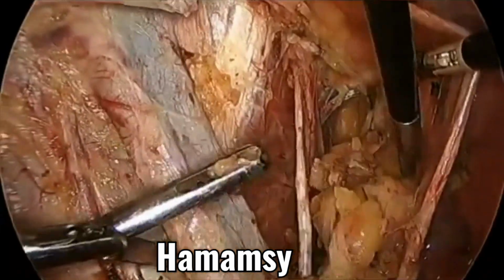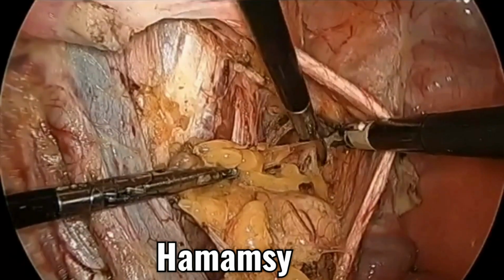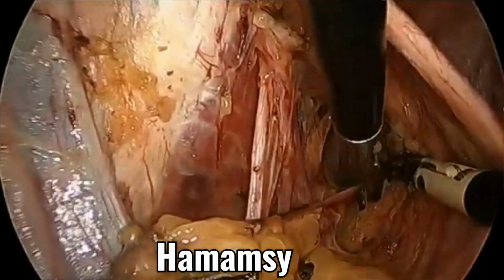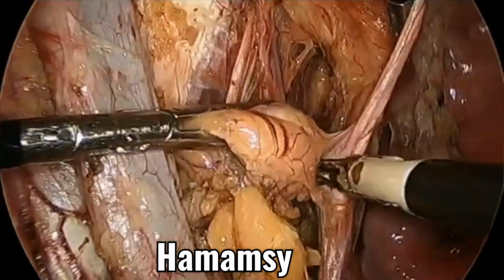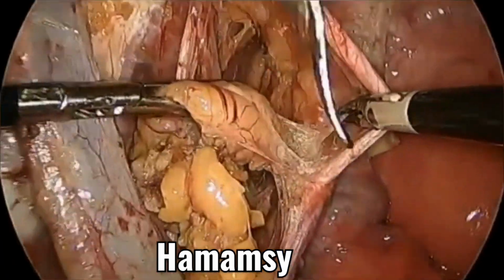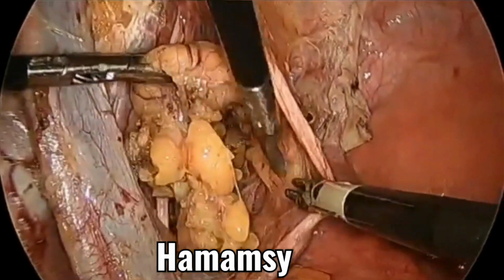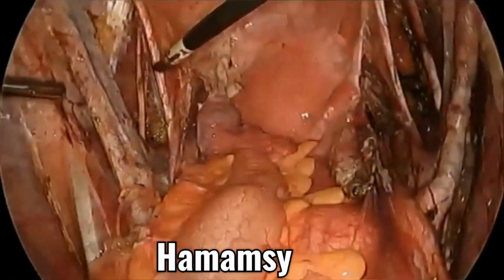Okay, very important to monitor any lymphocele and any nerve injury like obturator nerve injury post-op, any mobilization to prevent thrombosis, and very important to follow the early enhanced recovery program. Nerve to the obturator nerve. Okay, this is the obturator nerve.